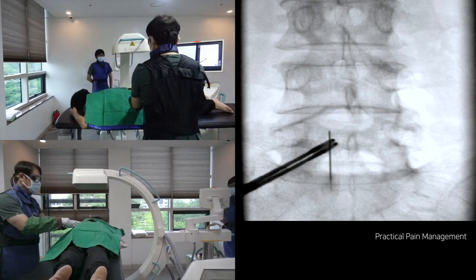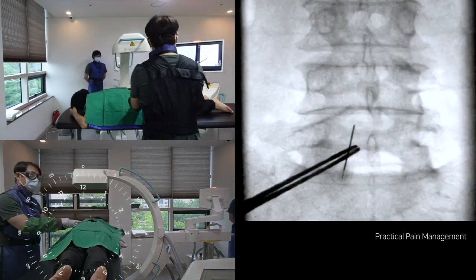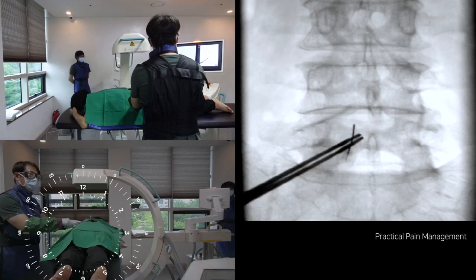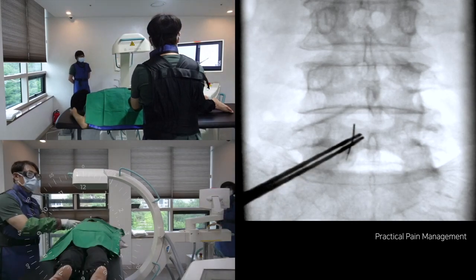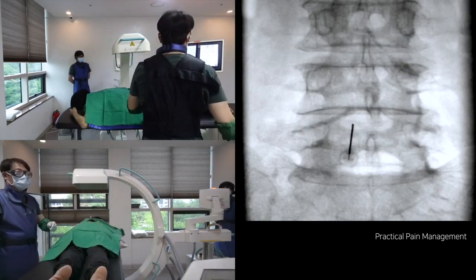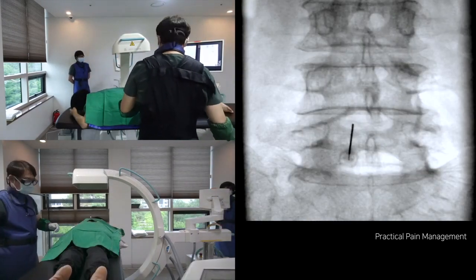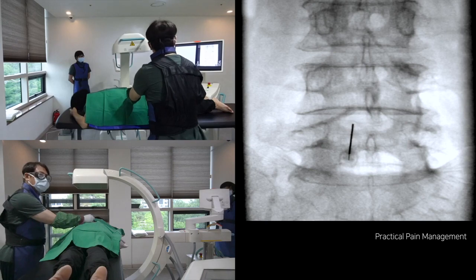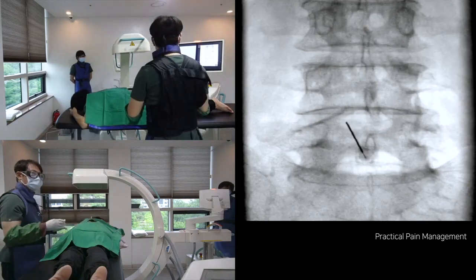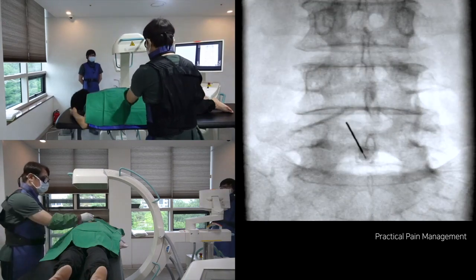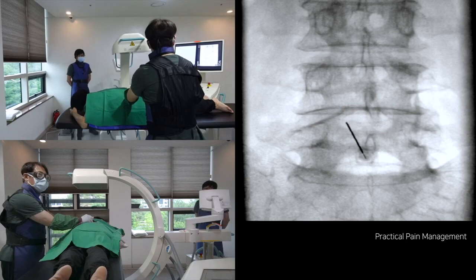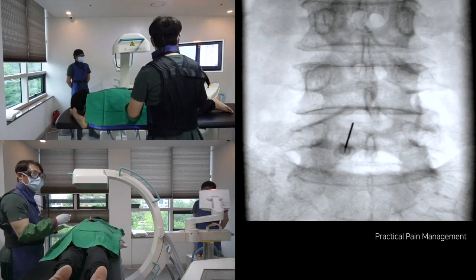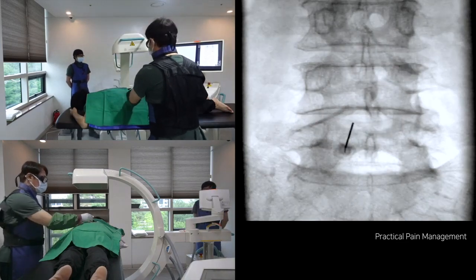Some doctors asked me how much I needed to push the needle before turning to a contralateral oblique image. But it depends on the patient. I rely on the patient's body mass. I move the needle about 3 cm in the case of a skinny patient, but it also depends on the sense of the fingertips.